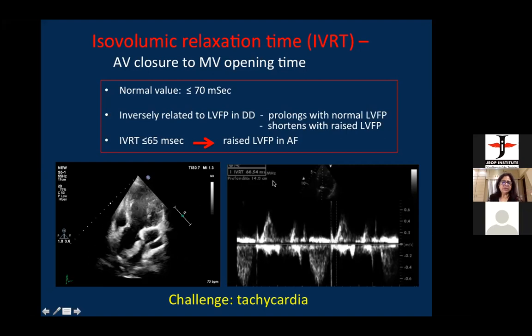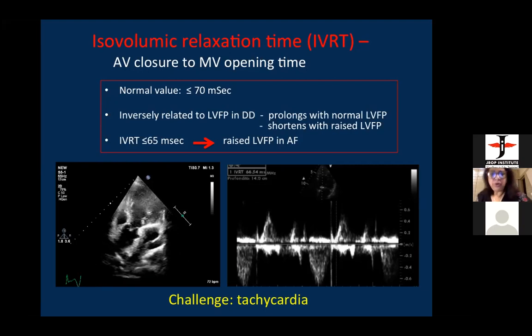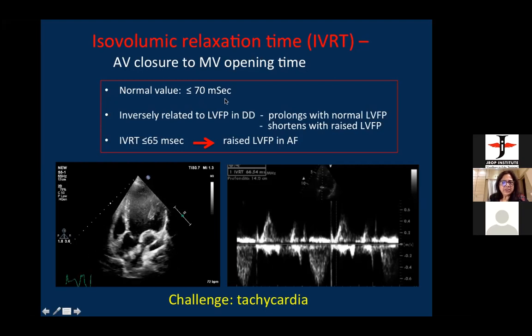Now tell me, where is your confusion? This is okay, ma'am. But for the grading, it is inversely related to the diastolic dysfunction. Okay, now the next point. What I said is that normally it is less than 70 milliseconds.